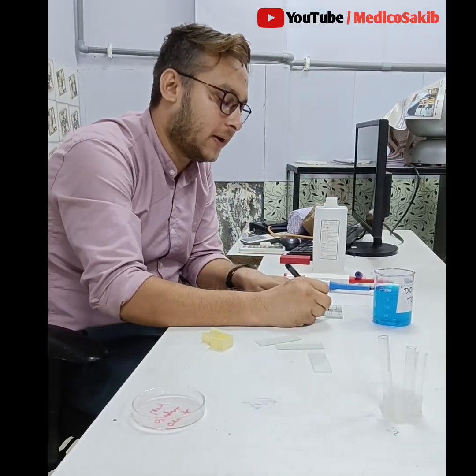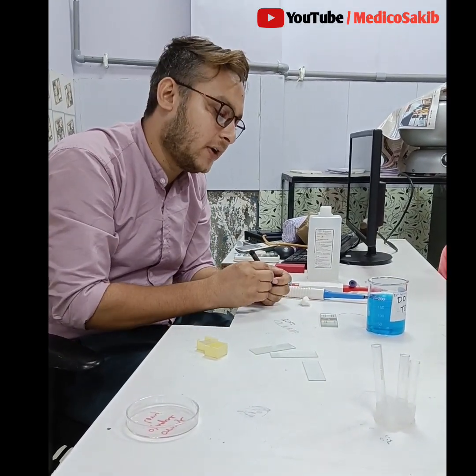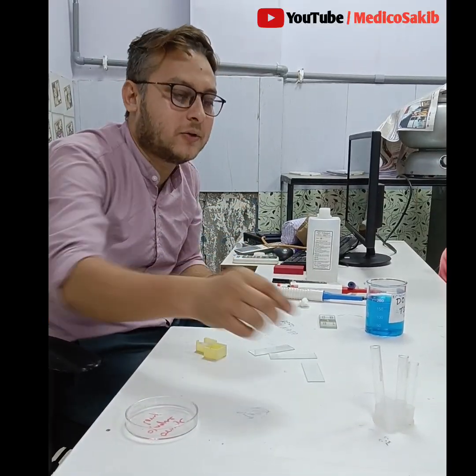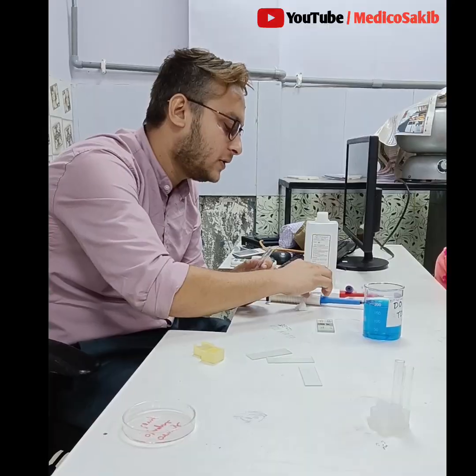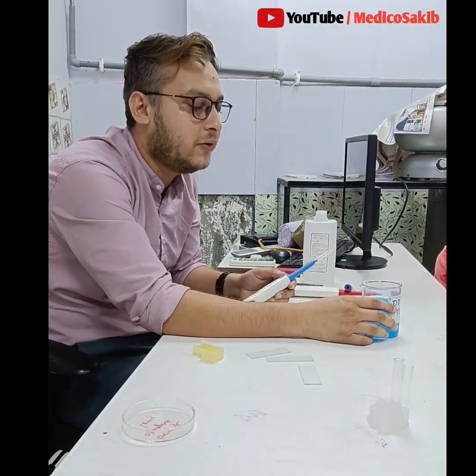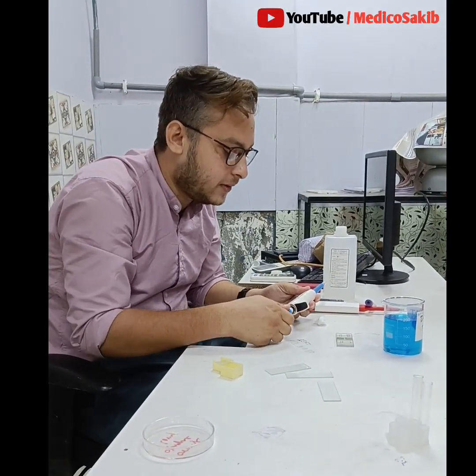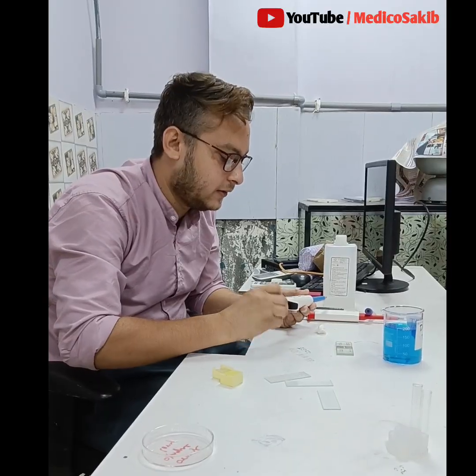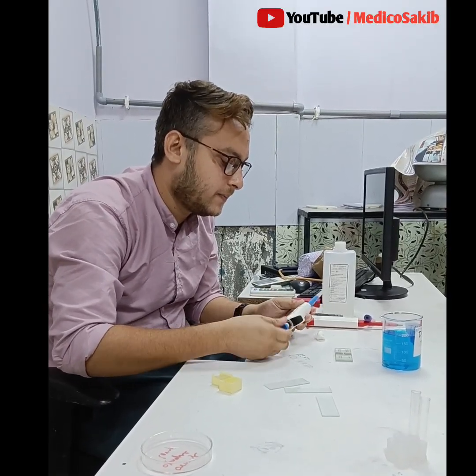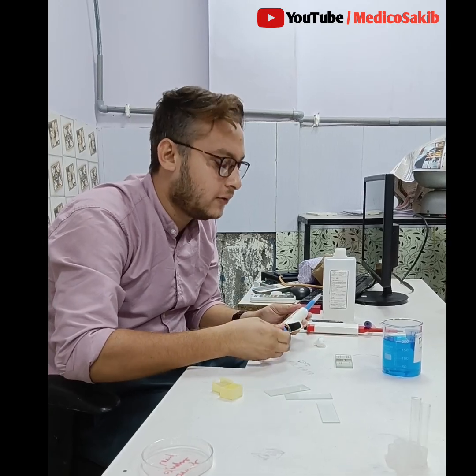Hello everyone. Today I will show you how to count WBC by using the hemocytometer. So we all know that hemocytometer is an instrument that is generally used for the counting of cells like WBC, RBC or platelet. In order to count the cell, we use different kinds of WBC or RBC or platelet diluting fluid which have their specific function. In today's video, I will count basically WBC.